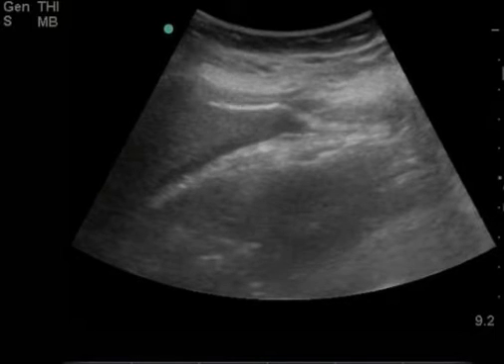You will see this finding on ultrasound about 10 times to 1 from an ectopic pregnancy to a ruptured ovarian cyst. And really the only way you can tell in this clinical setting is by opening up the abdomen and taking a look. So in this case, the patient was expedited to the OR, and there was indeed a ruptured ectopic pregnancy.